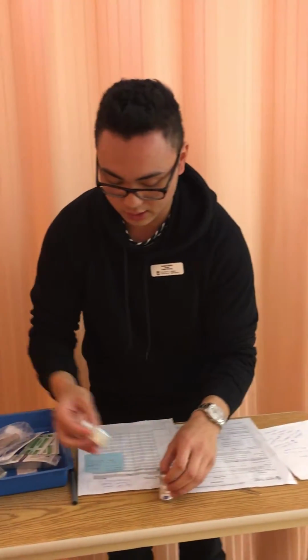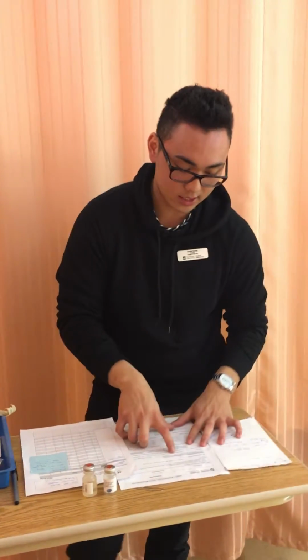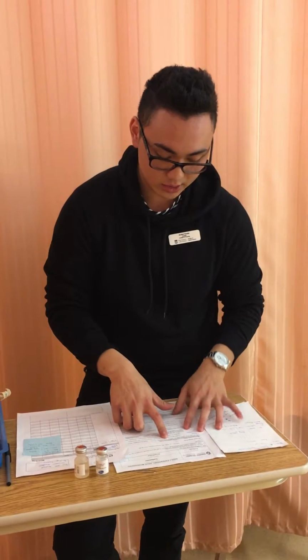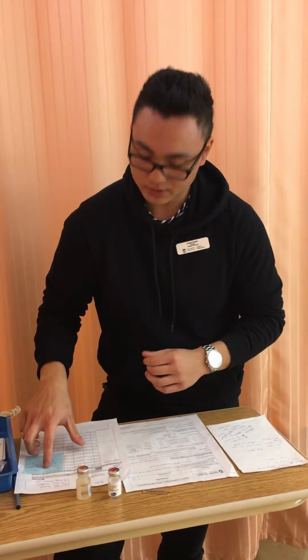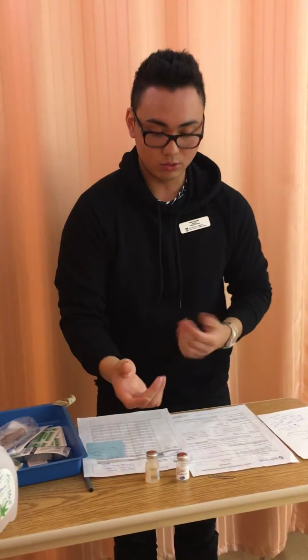Now we will do our reconstitution. It says that for a 1 gram vial we would have to add 10 milliliters of sterile water for injection. So we have sterile water here, and that final concentration would be 96 milligrams per milliliter. And according to my calculations, after reconstitution, we would draw up 7.9 milliliters.